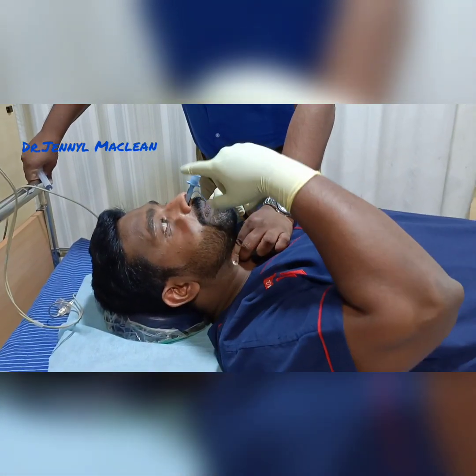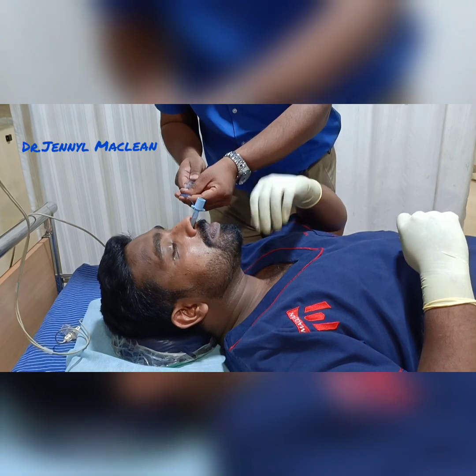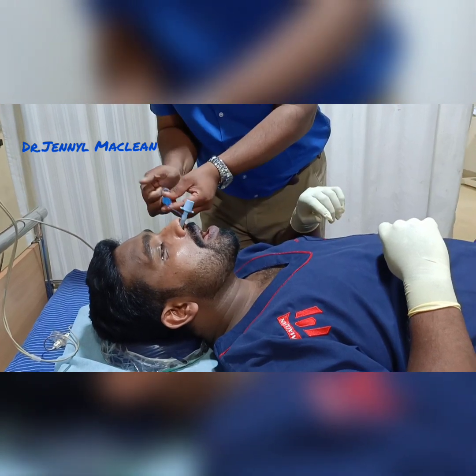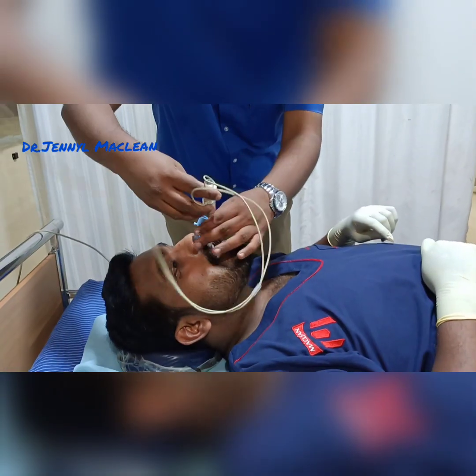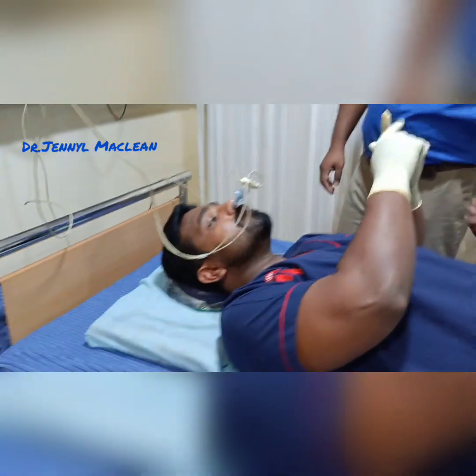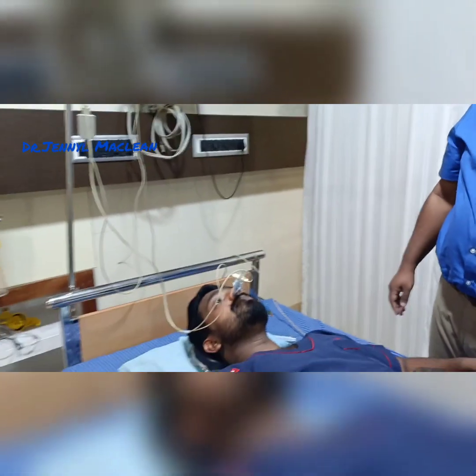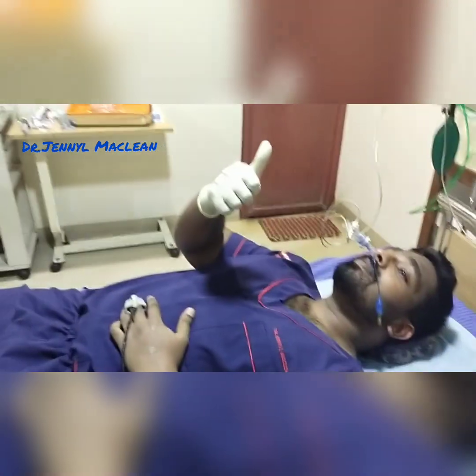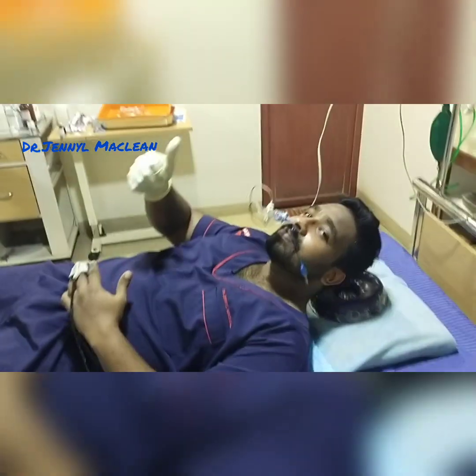That's the point I am here to prove. When your tube is inside, past the glottis, your cuff has been inflated. Then take a deep breath — you can hear the breathing sounds. Then attach the end-tidal carbon dioxide monitoring, and then your saturation probe. You can see the ETCO2 graph that confirms the endotracheal intubation. There is no discomfort — and that's a thumbs up. You can sit up with the endotracheal tube in situ.